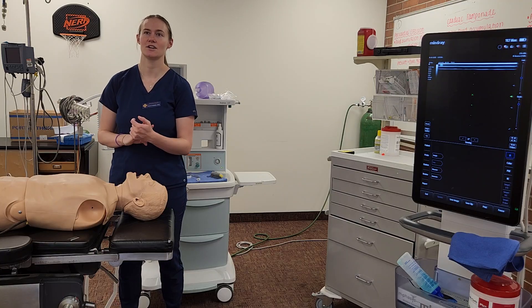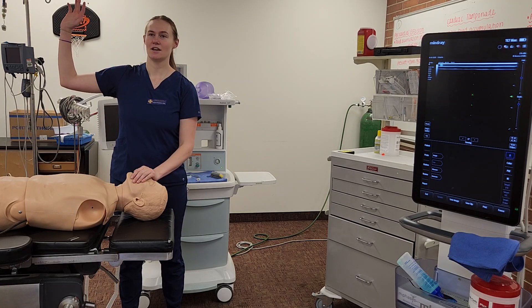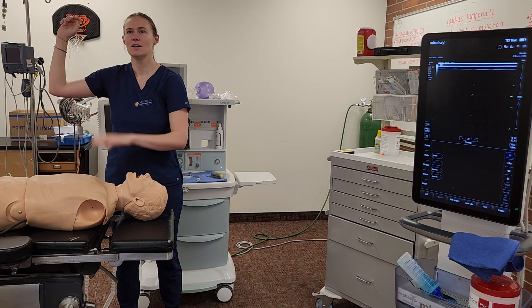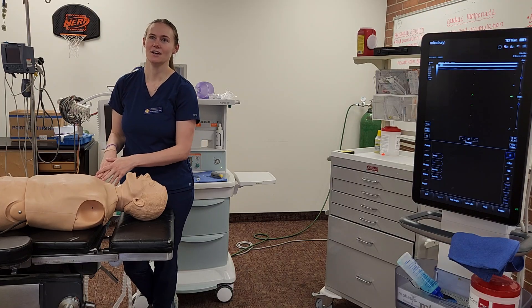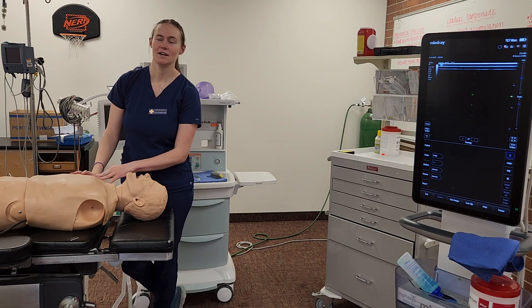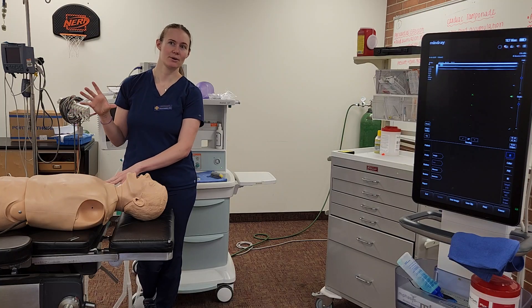The timeout confirms: right patient, right spot, right dose, right drug, right procedure. Then I'll identify my landmarks and nerves on ultrasound. The arm is at 90 degrees and I'll start with the armpit. Typically the nerve is one to three centimeters below the skin, and the axillary artery is around that area — it's pretty shallow. I'm looking for the median nerve, which is superficial and lateral to the artery; the ulnar nerve, which is superficial and medial to the artery; and the radial nerve, which is posterior and lateral or medial to the artery depending on anatomy. The musculocutaneous nerve is further off in the fascial plane between the biceps and the coracobrachialis muscle, and it often appears as a hypoechoic oval structure with a bright hyperechoic rim, like a snake eye.